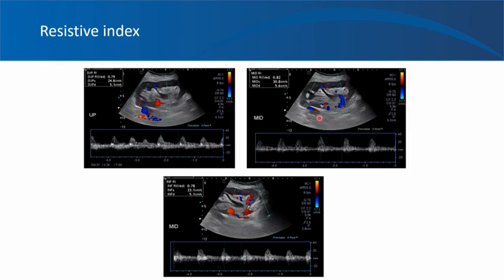And here, the Doppler gauge is somewhere in the middle of the kidney. So it's measuring resistive index in the middle arcuate artery. And the machine says it's 0.82. And here, the arcuate artery that we are measuring in is in the lower pole, that is the lower arcuate artery.